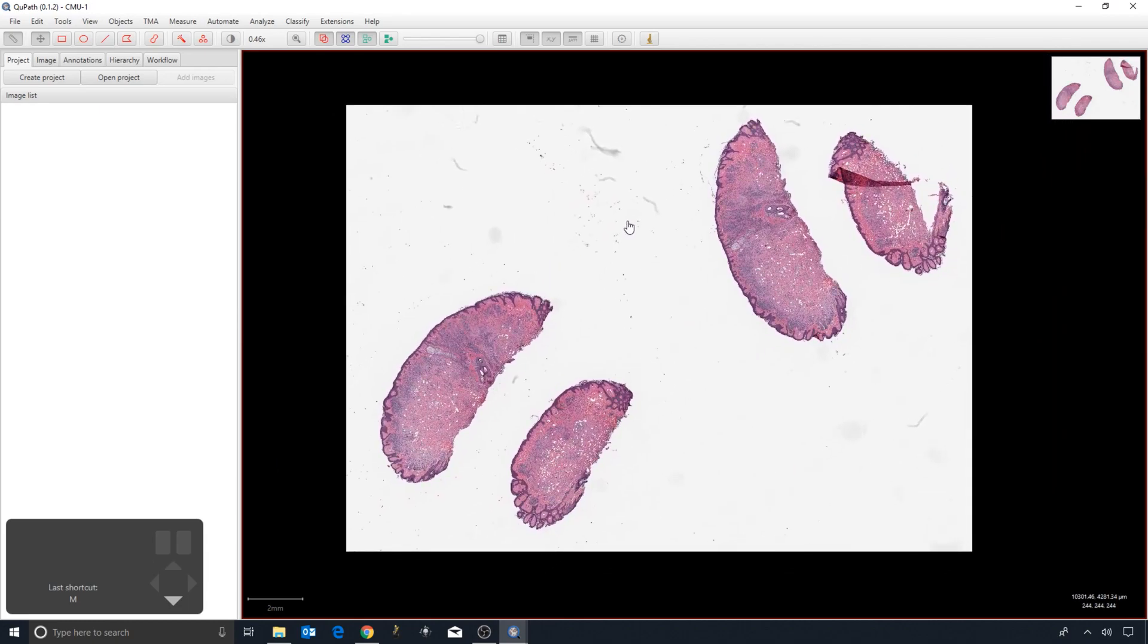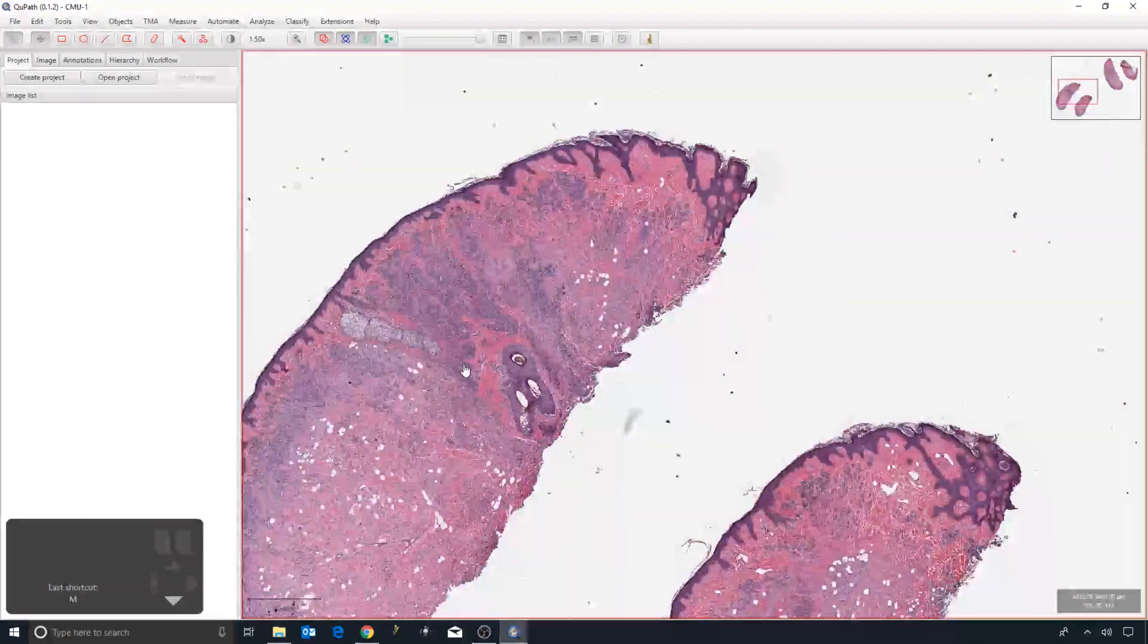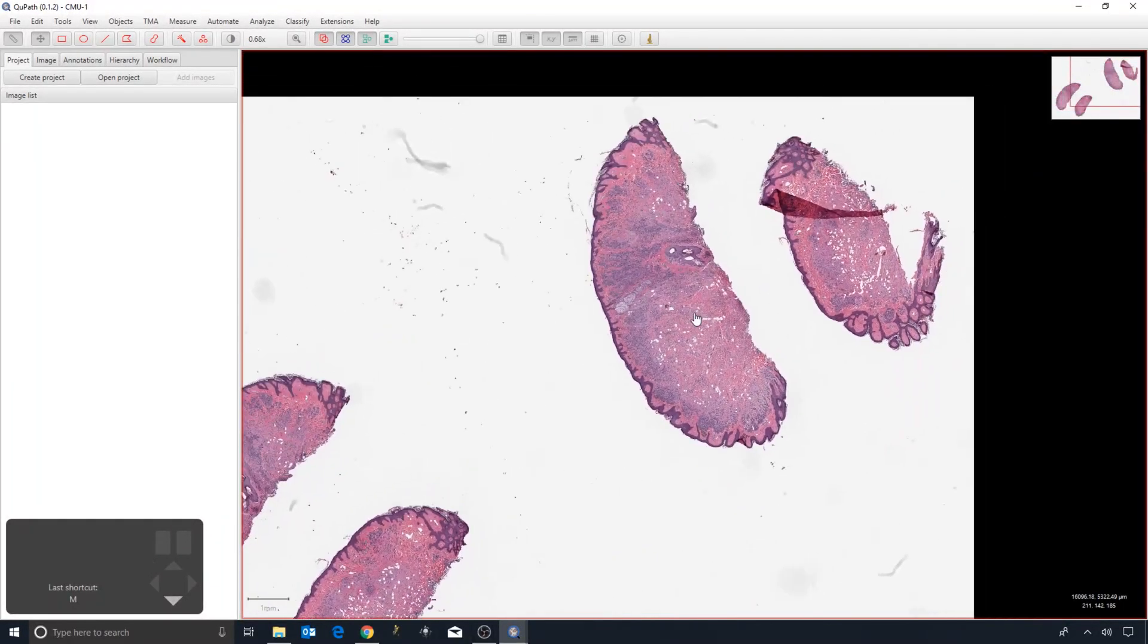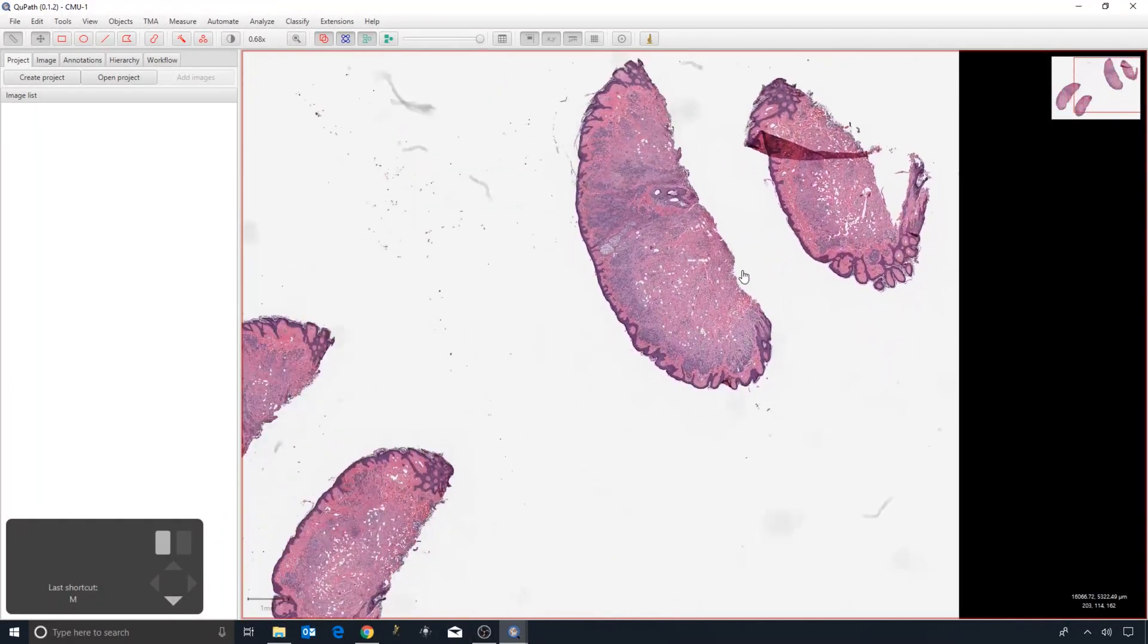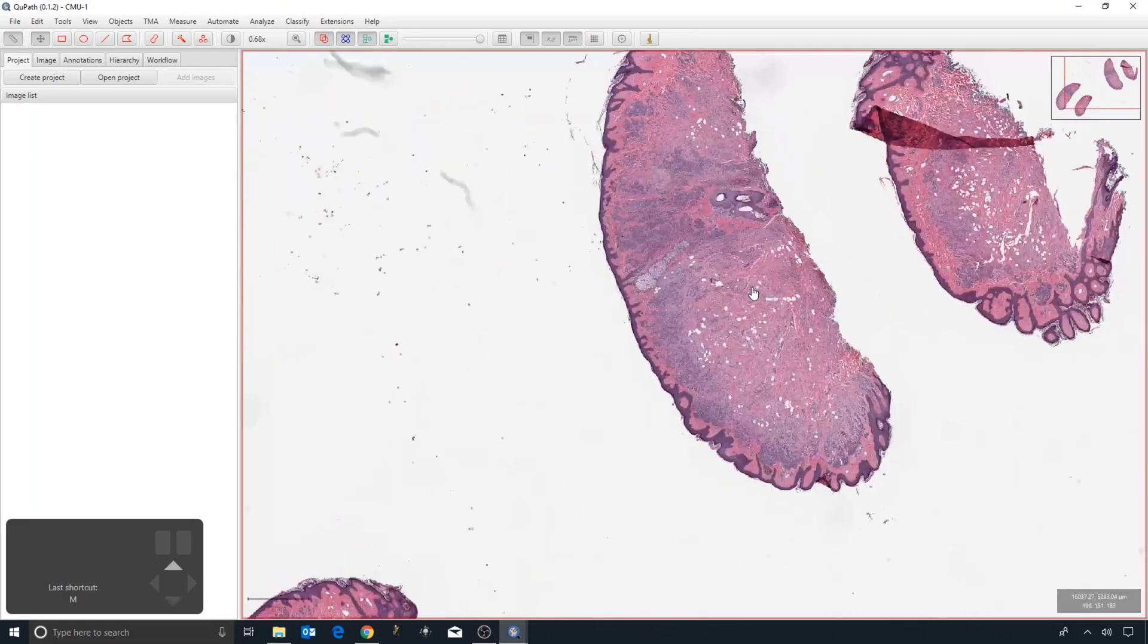Going back to the image that we opened: we drag the file on top of QPath and we want to navigate it. The basic controls are: we can use the mouse wheel to zoom in and zoom out, we can click on the image and drag it to move around and change the field of view.